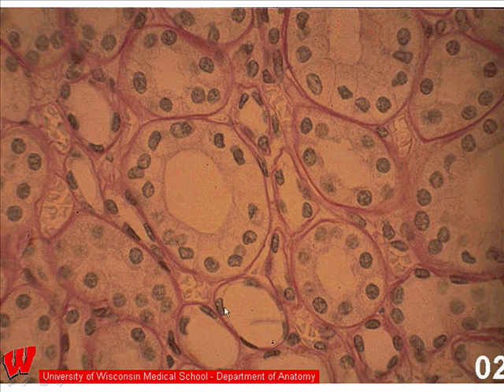Starting with the simple squamous epithelium, which I'm pointing to down here, please note that the nuclei are very flattened and elongated around this lumen. And compare that to a tubule which is just to the right of it. This is a simple cuboidal epithelium. The definition of simple cuboidal epithelium is that the height of the cell is approximately equal to its width. And you can see that the nuclei are pretty much central in these cells.